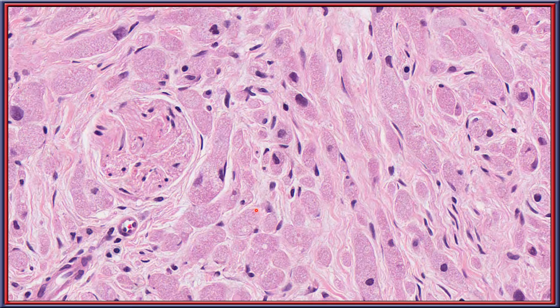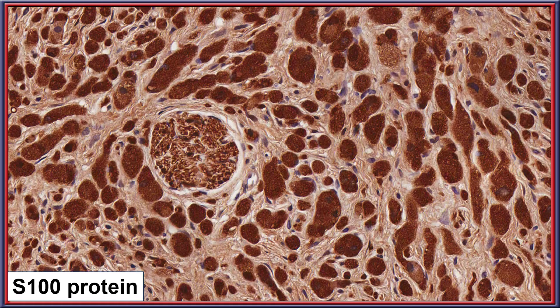Perineural involvement is quite common. There is a notable similarity between the nerves and the tumor cells, as each has granular cytoplasm. The polygonal quality and eosinophilic cytoplasm are characteristic of the lesion, with S100 giving a strong nuclear and cytoplasmic reaction in the neoplastic cells, with the nerve serving as an internal control.